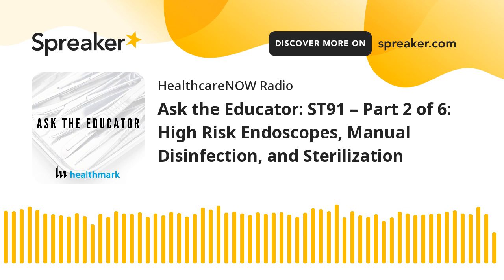Just test every scope every time because you want to have the same standard of care. And I get that, and that's fine. That's a more conservative approach than what we're requiring in the standard, but we do have that designation: all high risk scopes every time, and non-high risk, that statistically significant portion. So I hope that answers your question in a long-winded fashion.